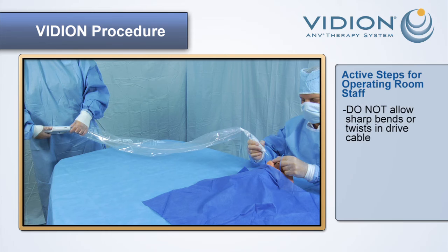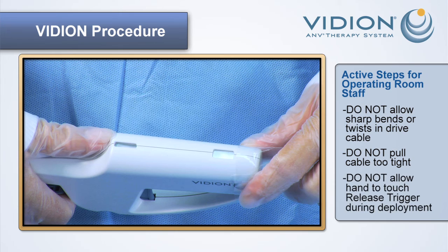Do not allow sharp bends or twists in the drive cable between the disposable delivery module and handheld cable actuator, as this could affect deployment or retraction or slow down the rate of travel of the source. Do not pull the cable so tight that it interferes with the ability of the retinal surgeon to maneuver within the eye. Do not allow your hands to touch the release trigger during deployment.